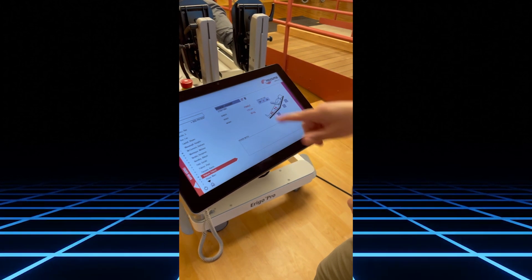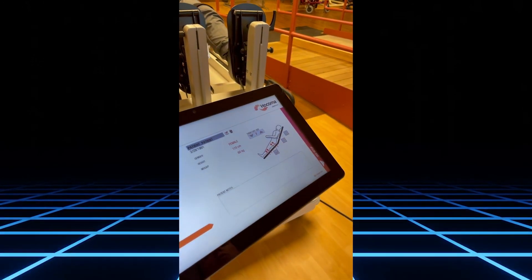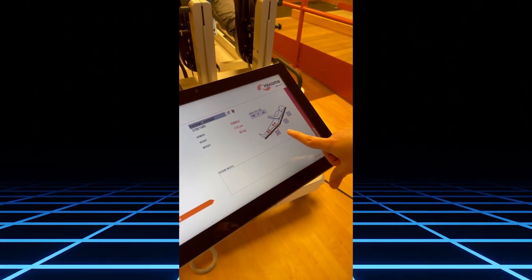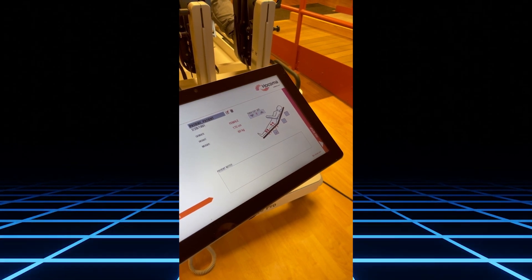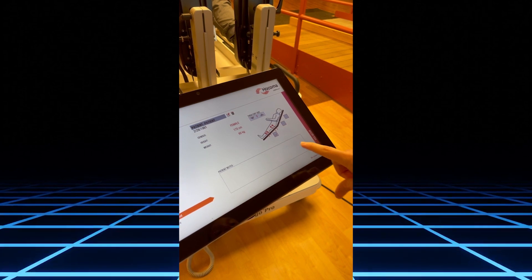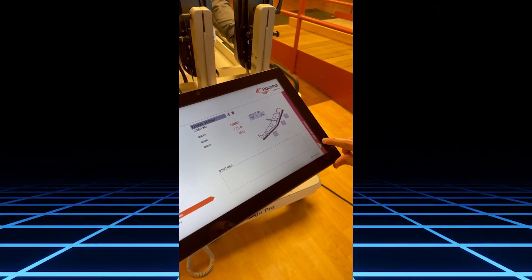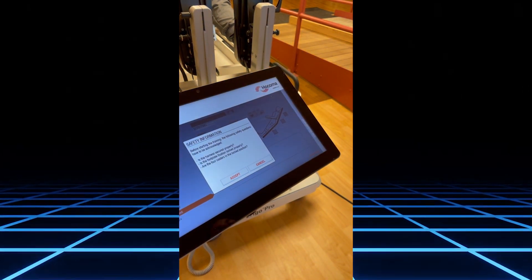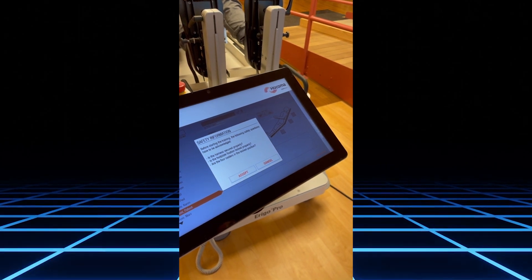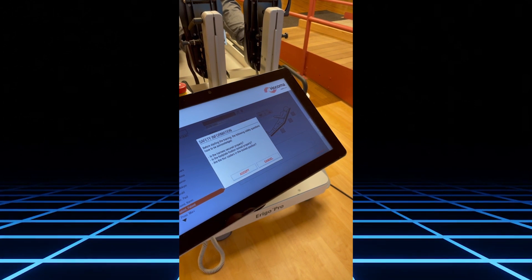With our patient set up, you need to change the thigh cuff size to what we selected previously. We do have FES for the lower extremities — the hamstrings, quads, gastrocs, and tibialis anterior. If you're not using FES, uncheck that. The next step is range of motion measurement. There will be a safety information screen asking if the harness is secured properly, the footplate fixation is locked, and if the four casters are in the locked position.